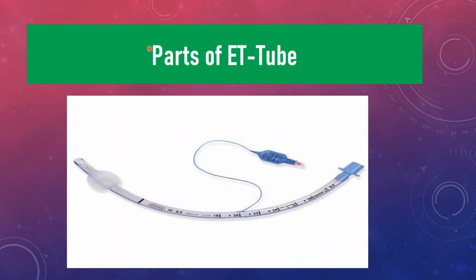So next are the parts of the ET tube. What are the main parts of the ET tube? The ET tube is divided into three main parts. First is the proximal end. The proximal end is about 15 millimeter in diameter. This is the standard size of the proximal end, so that it can connect easily to the ventilator tubing and ambu bag. This is the proximal end.